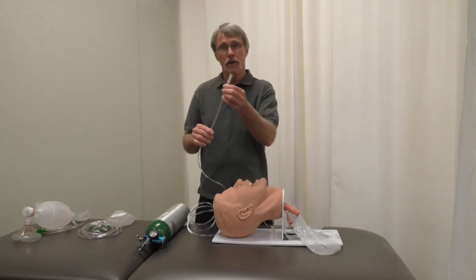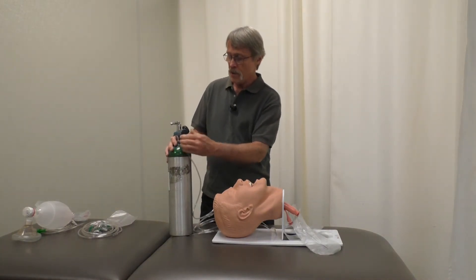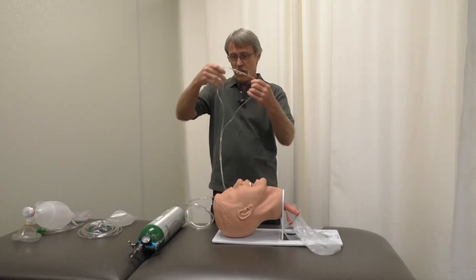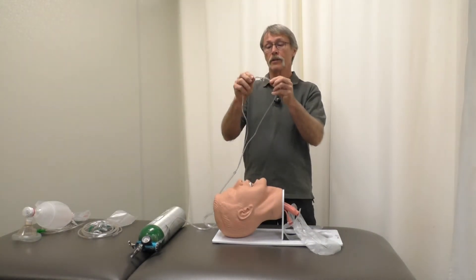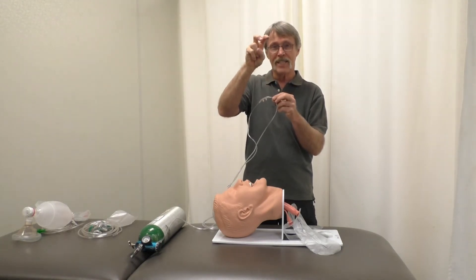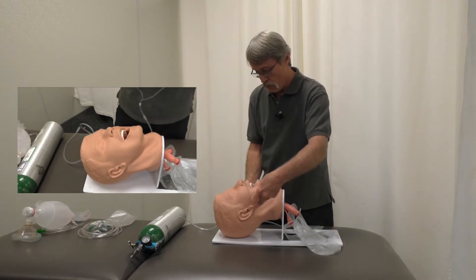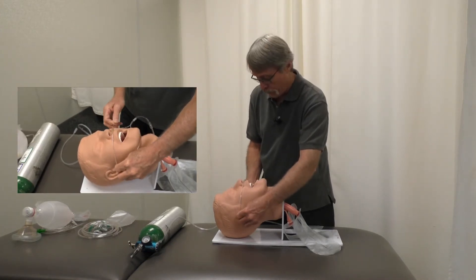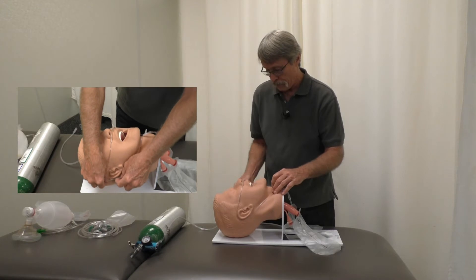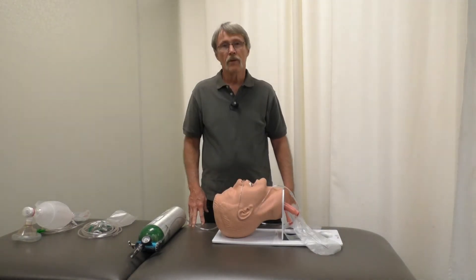You take the end and place it on the barb here, then turn it to 4. How you place this is you take the prongs — they're shaped like a rattlesnake's teeth — and come down underneath the nose like that, resting on their upper lip, then loop the tubing over the ears. Then you cinch it up and make sure the patient is comfortable.